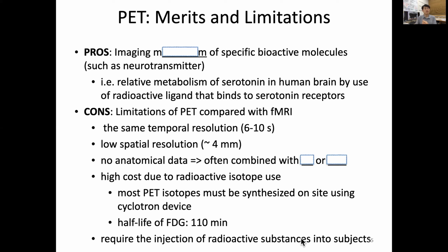So remember, for example, our institute has a micro PET, but we don't have a cyclotron. In that case, we have a little limited use of micro PET because in the local hospital, there's a cyclotron. We actually order it. There's a quick service delivering it within several tens of minutes. Then we have only a limited time interval to image, to run the PET. So that is a kind of a limitation. But however, it gives a great metabolic information.